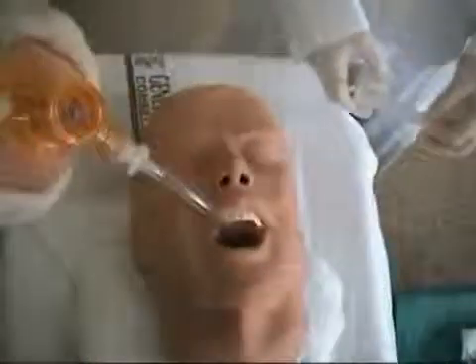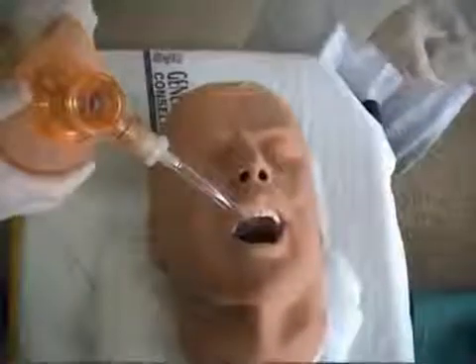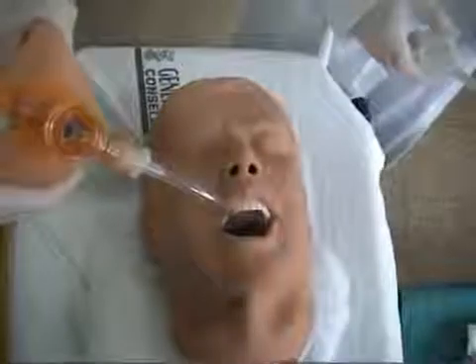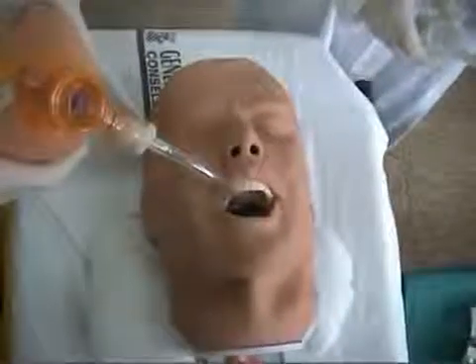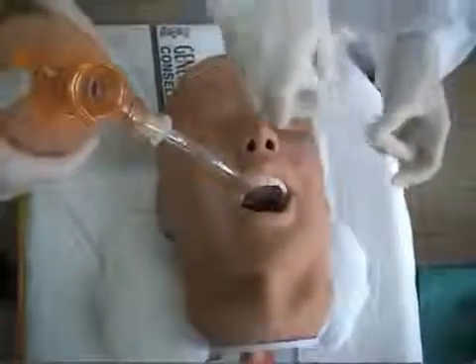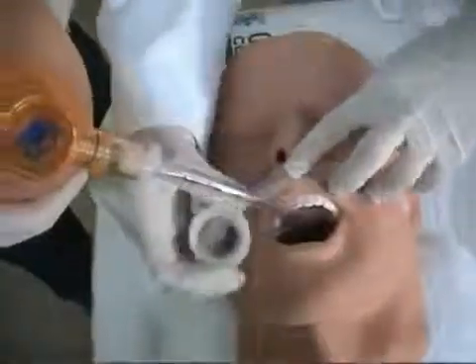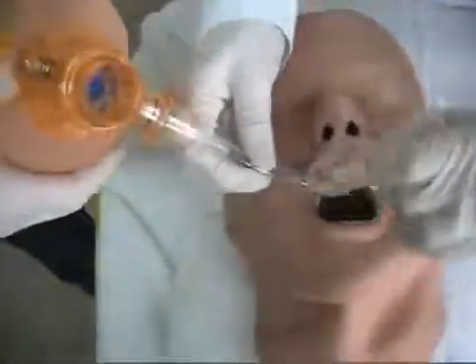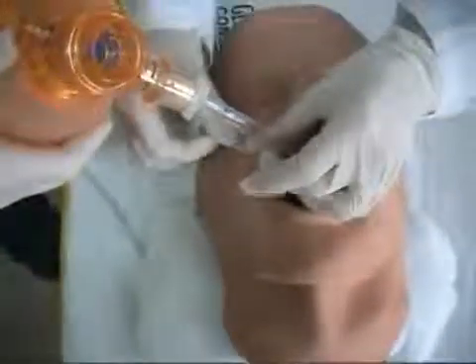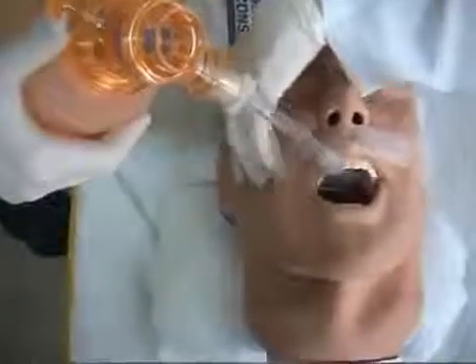The last step is to secure the endotracheal tube to the patient's head once proper position has been confirmed, using tape or, if available, an endotracheal tube holder. Using tape, attach the tape to the patient's cheek and wrap it circumferentially around the endotracheal tube, and next fix the free end of the tape to the patient's other cheek.